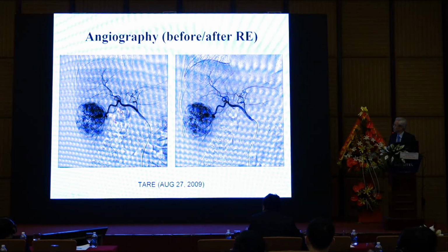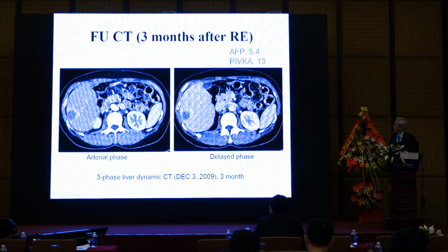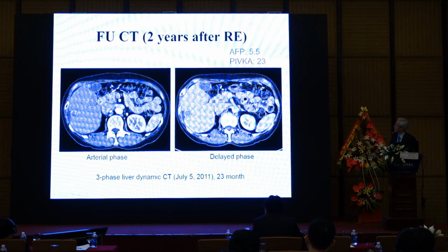The radioembolization was performed. After radioembolization, you can see all of the vessels are widely patent, even after Y90 injection. After that, the tumor slowly decreases in vascularity and size, and tumor markers rapidly decrease. At 3 months, 6 months, 2 years, the tumor was completely necrotized.